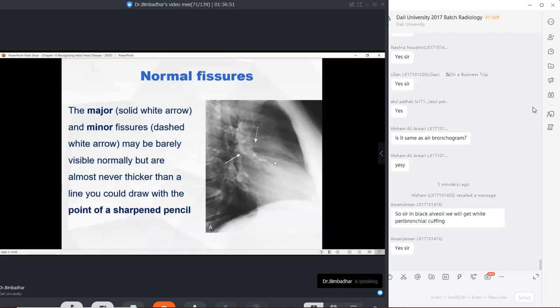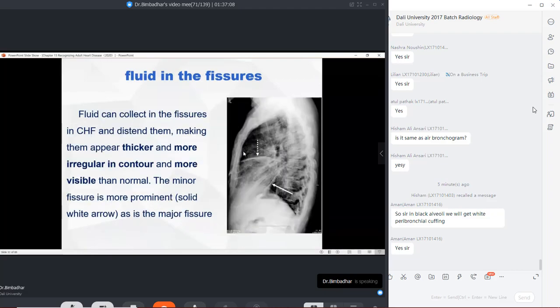Right here also, you see a very thick line, which actually suggests that the patient will eventually develop an encysted pleural effusion. So this is also talking about the progression of the patient's condition, right? Fluid in the fissure here also, you see, has almost started developing a lot of fluid, and it is flowing downwards because that is the dependent part.